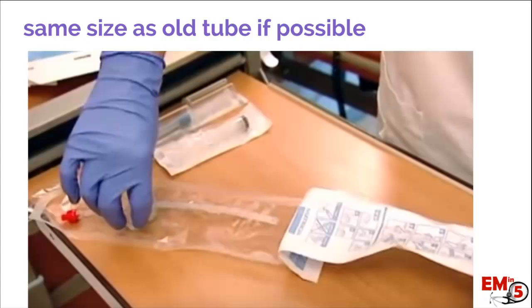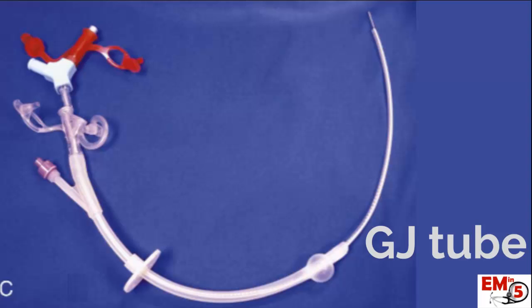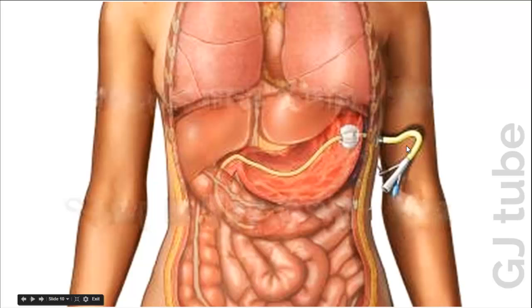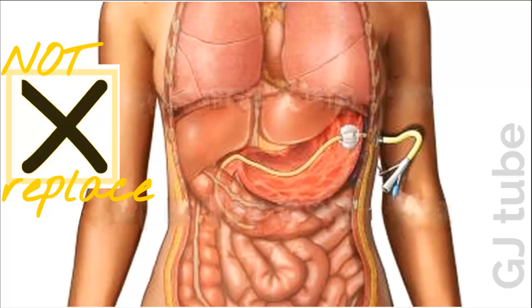Now what if they bring you this kind of tube — is this just a really long G-tube? The answer is no. This is actually a G-J tube. If you're lucky, it'll say it right on the port, but it might not. What should warn you is that you're going to have this really long tubing after the balloon. It goes through the abdominal wall into the stomach, you blow the balloon up, but then there's all this extra tubing and it actually goes through the gastric outlet and into the jejunum. If you tried to replace that yourself, you'd just end up with all this tubing coiled in the stomach and it wouldn't really be a definitive placement. So as ER physicians, we can put in a placeholder, but we can't definitively replace this tube.